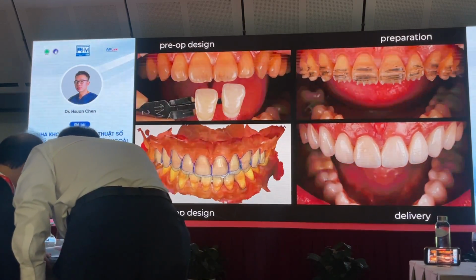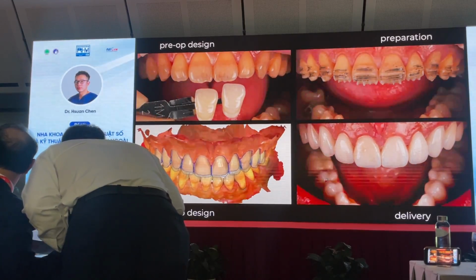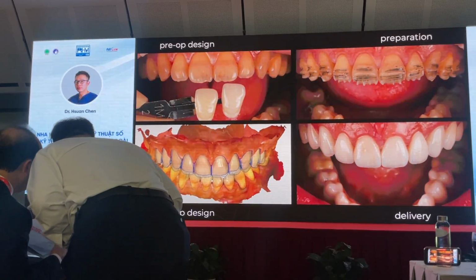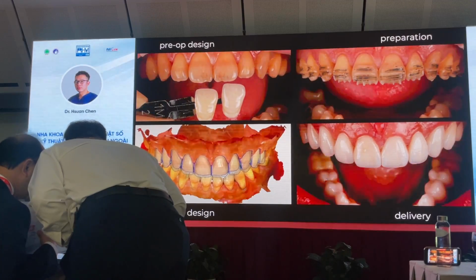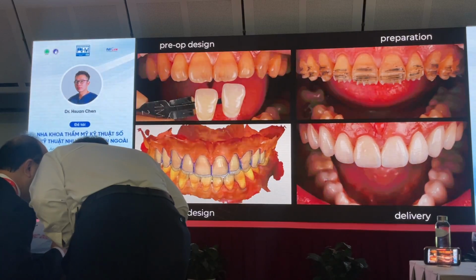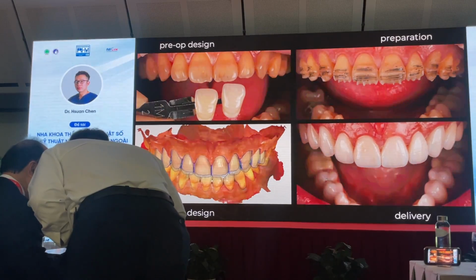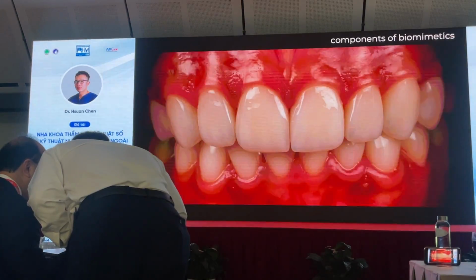Okay? And because this happens within the same day, there are some limitations. And the limitation is that we, as dentists, have to choose the ceramic. Right now, when you're doing traditional ceramic dentistry, you're probably writing out the ceramic or the color that you want. You don't actually choose the ceramic that you use. But in chairside dentistry, we have to be familiar with what ceramics to choose.